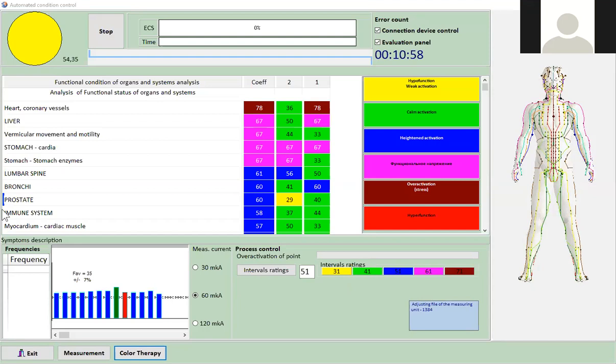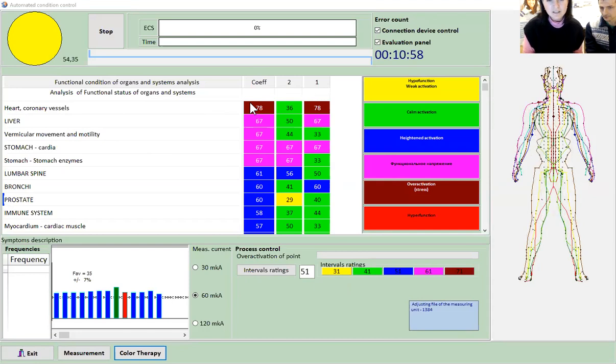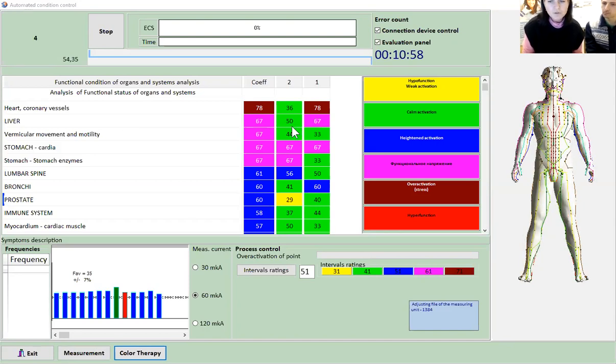Yes. So here you already can see a few measurements, for example. There were 3 measurements: the first one, then the second one, and the third one. COF is like the last measurement all the time. So basically you have to find the jumping organs. At this point, heart and coronary vessels are jumping. Look at the first measurement, 78, then 36, then 78. You see, it goes up and down, up and down. So this is not a balanced organ. Liver is a little bit unbalanced. So you search after that.